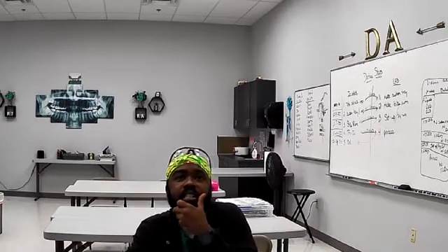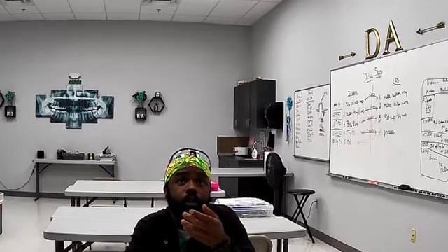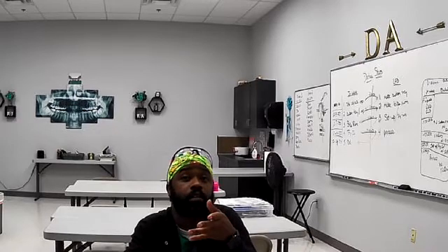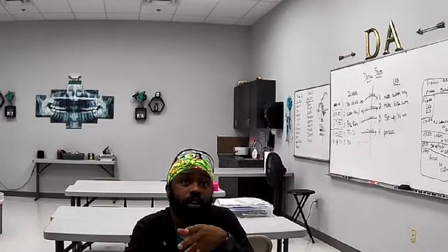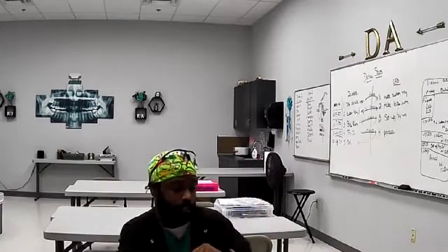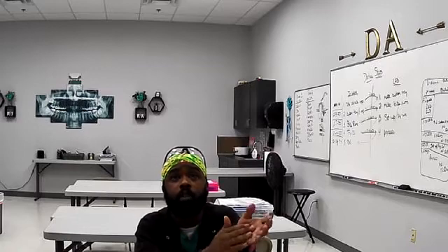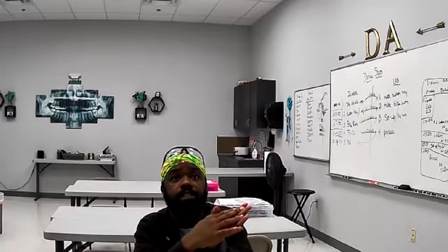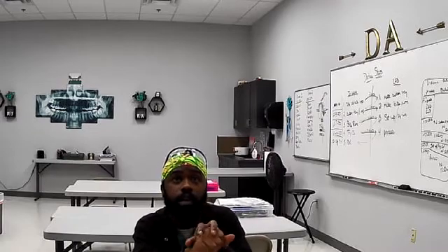If your dentist uses the traditional X-rays, you'll be asked to bite down on a piece of plastic that holds the X-ray film against the upper and lower teeth. And if your dentist uses digital X-rays, you'll be asked to bite down on a little box that's wrapped in plastic. So that's basically the one that we've been learning, the digital X-rays, as far as sensors and sensor holders.